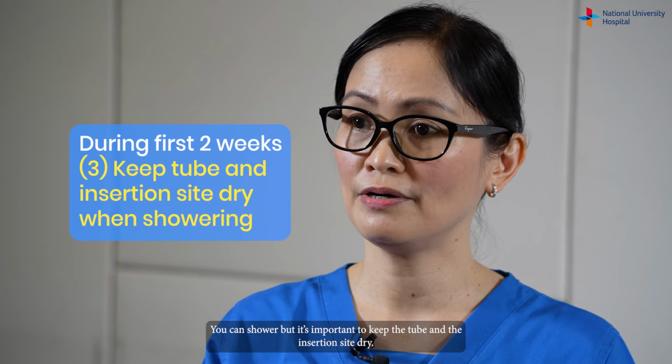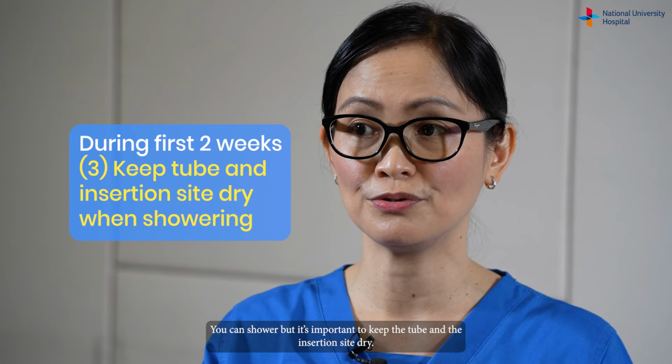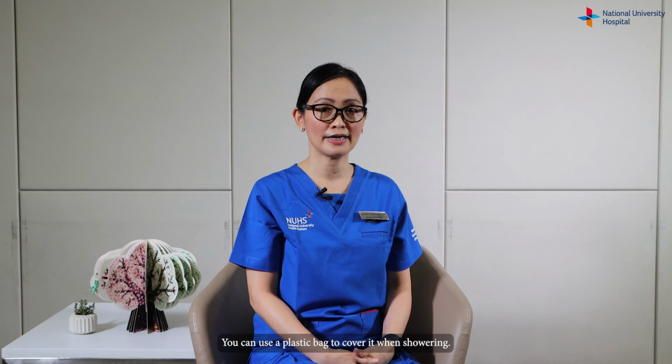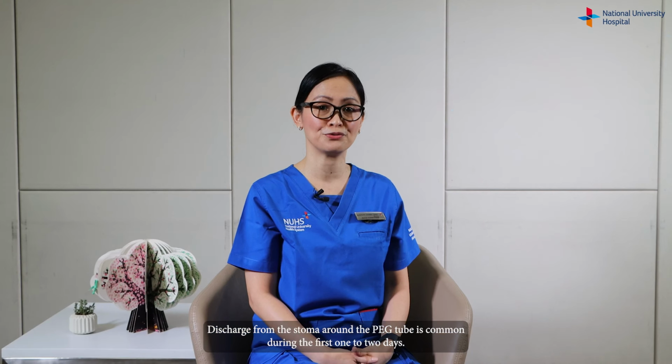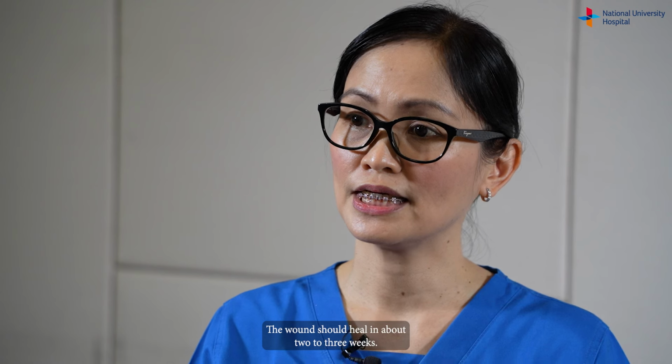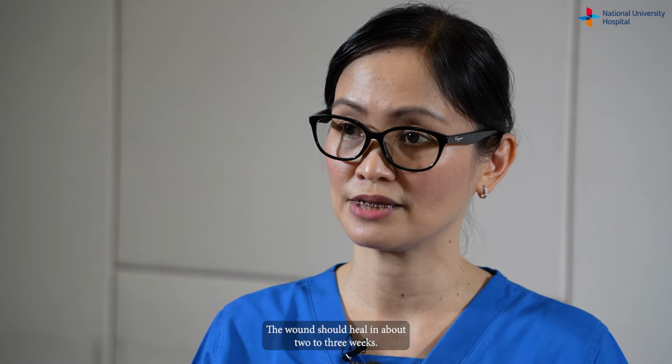You can shower, but it's important to keep the tube and the insertion site dry. You can use a plastic bag to cover it when showering. Discharge from the stoma around the PEG tube is common during the first 1 to 2 days. The wound should heal in about 2 to 3 weeks.